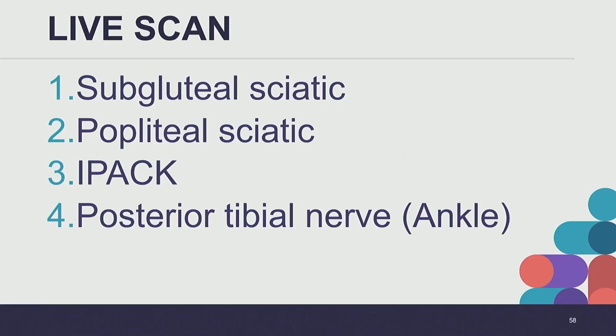So do you think that the medial is safer than the lateral approach in terms of avoiding the common peroneal nerve or not? I think as long as you can visualize where they are and you're injecting into the plane close or not, you should be able to avoid it. I do tend to do the medial approach more often, like medial approach with the needle.